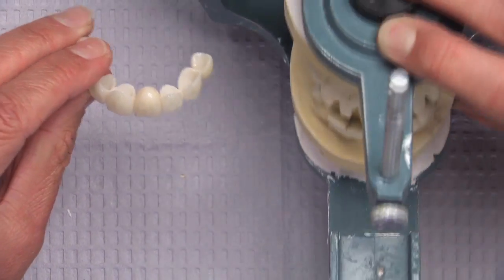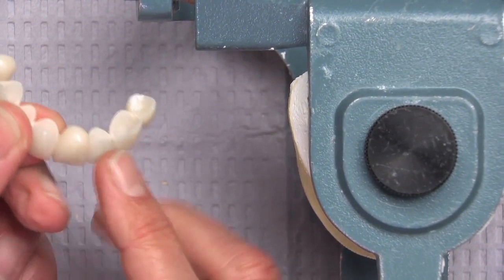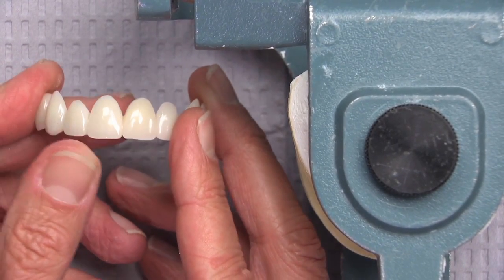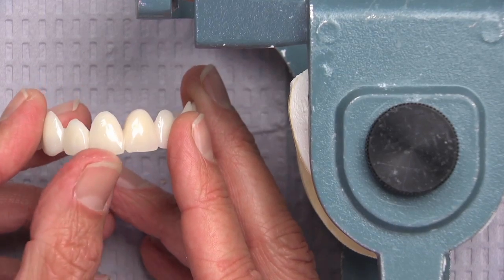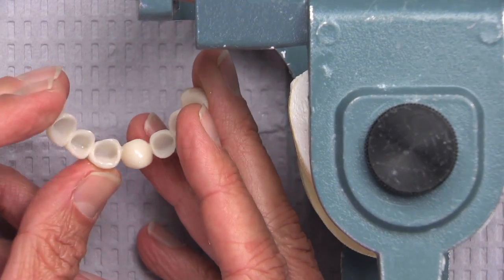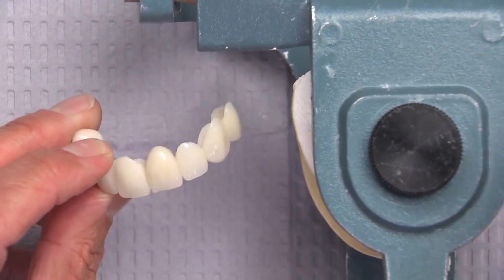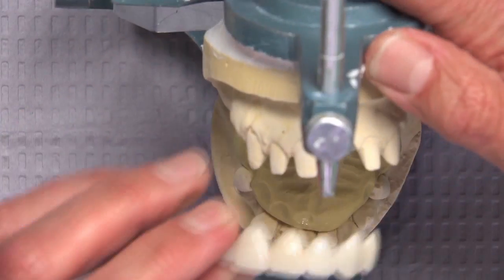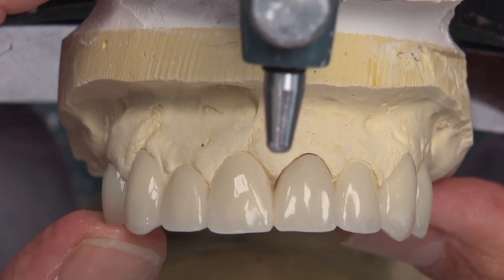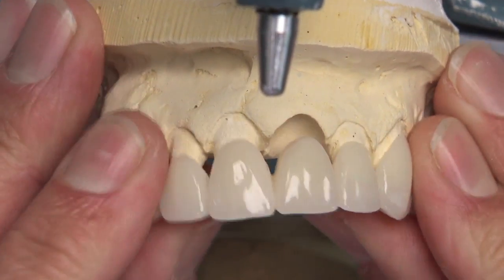I want to point out here on the pontic — we've got the development of the ovate pontic receptor site. You can see those two centrals are the same length. Keep in mind that tooth number eight is an abutment and tooth number nine is a pontic, but we want to make sure that when they're sitting on the tissue, the gingival levels are the same on teeth number eight and nine, because that's really important for the overall aesthetics of this case. As we put it back onto the model, you can see that eight and nine are now the same length at the gingival margin.